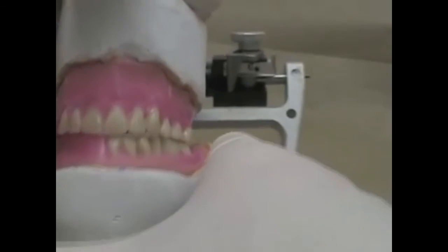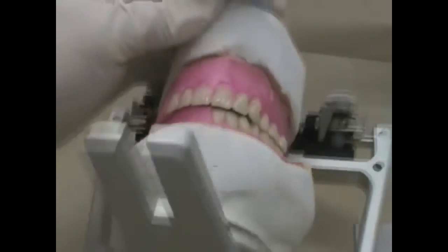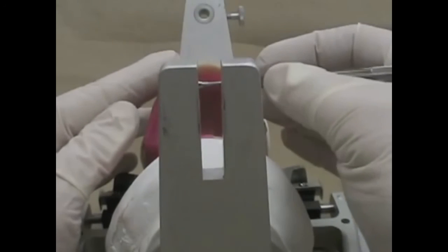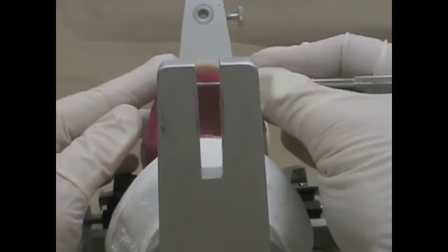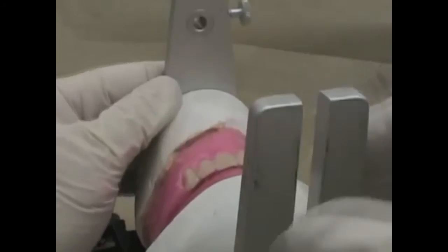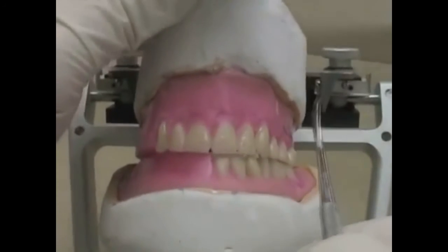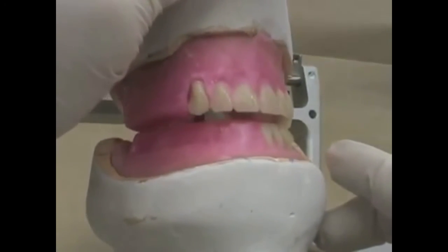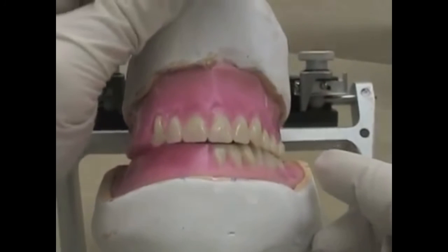That may have made the neck a little less prominent there, so I'm going to actually just heat that up and push the neck out from underneath. Okay, so I get a little bit more prominence there, and again, I'm just going to move that up so it's not too long. Okay, it should look symmetrical with the opposite side, and again should be slightly lower than the incisal edge on the lateral incisor.